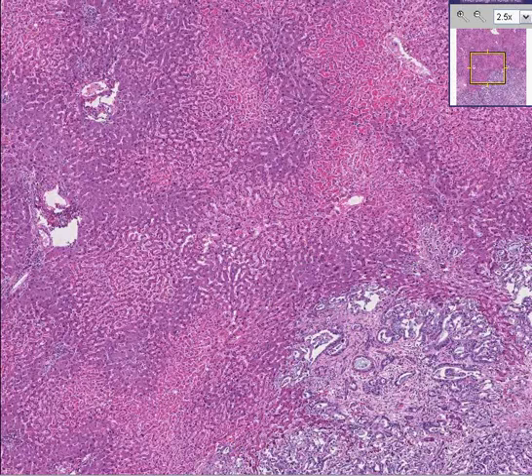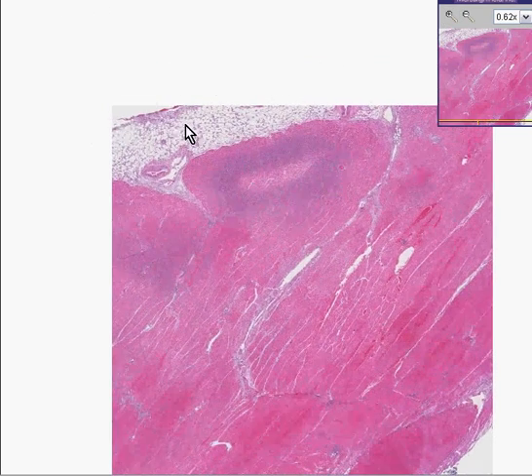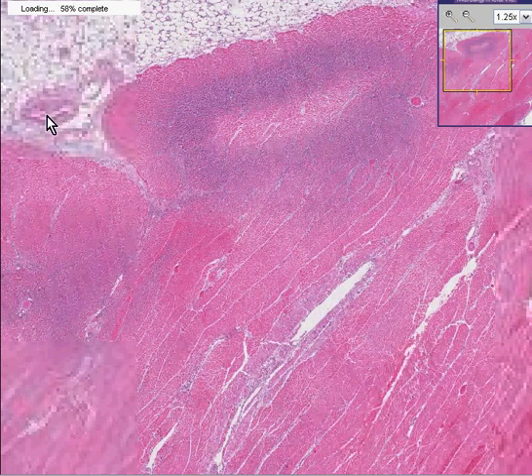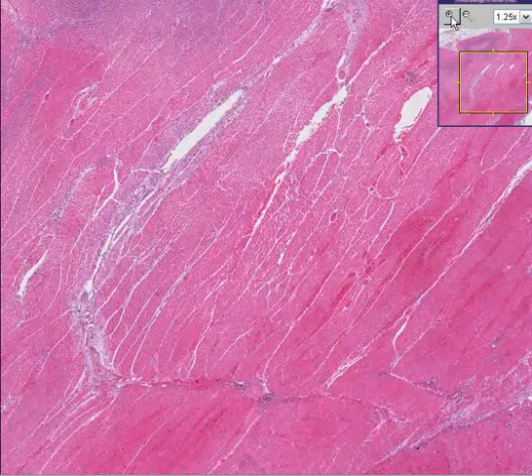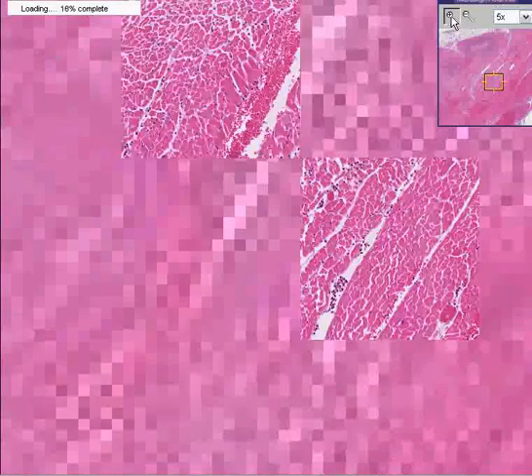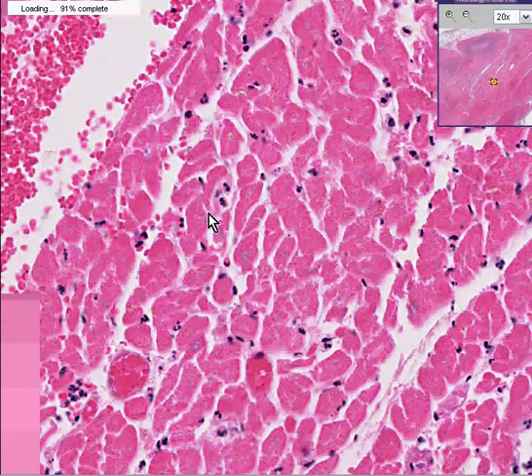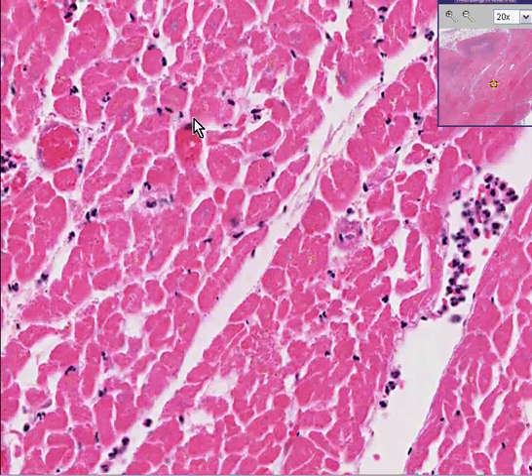In addition, in this third organ, all from the same case, we'll soon recognize that this is myocardium. You could see subepicardial fat right here. You could see the large arteries running in this subepicardial fat. I think you could recognize the fact that we have cardiac muscle here because we have muscle fibers in which the nuclei seem to be centrally located. But in addition, we start to see infiltrates of neutrophils within this muscle.